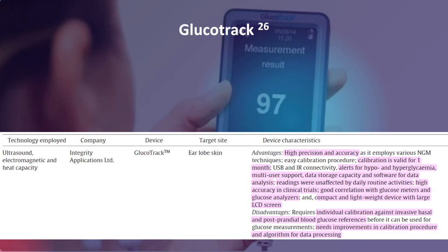calibration being valid for 1 month, having alerts for hypo and hyperglycemia, with multi-user support, data storage capacity and software for data analysis, the readings being unaffected by daily routine activities that the patient does, and having high accuracy in clinical trials with good correlation with glucose meters and glucose analyzers. The device itself is also compact and lightweight with a large LCD screen. However, some disadvantages include requiring individual calibration every month and requiring improvements in the calibration procedure and algorithm for data processing.